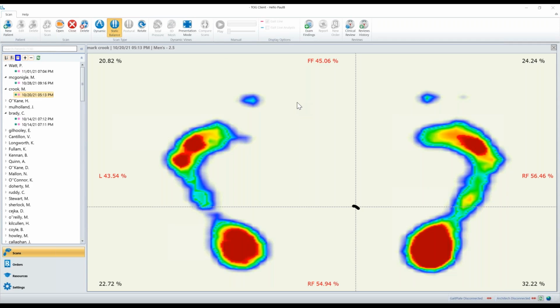Do we want to do dry needling in the calf muscle or myofascial release? So it becomes more than just stand on the plate for 5 seconds, step off, and let's get you into an orthotic. It generates an appointment for rehabilitation, and it's not needless rehabilitation. The reason it's not needless rehabilitation is because when you see no toes on a scan, it will generally be due to a tight posterior compartment.